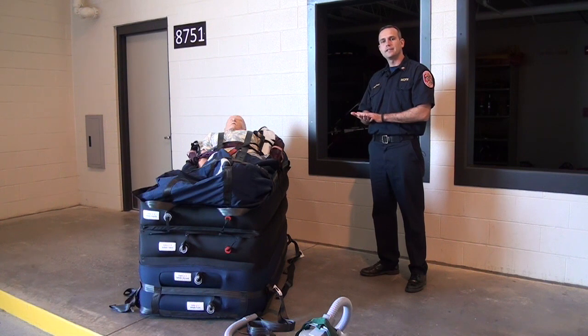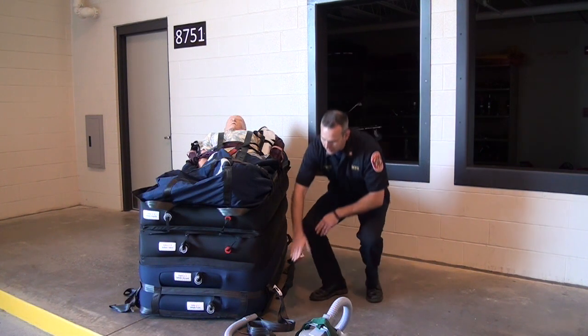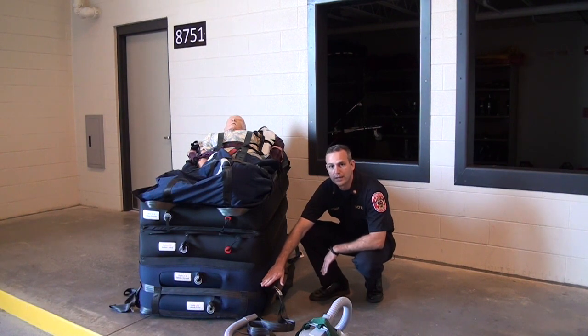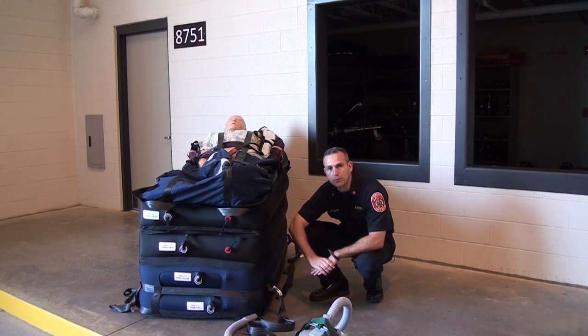When we go down the stairs with this device, it's important that we only inflate chambers one and two. We can't go down the stairs with chambers three and four fully inflated, so we only want to inflate the blue chambers if we are using this device to go downstairs.